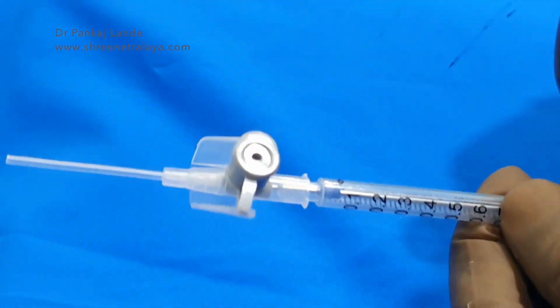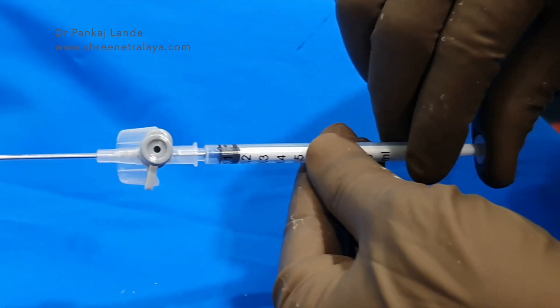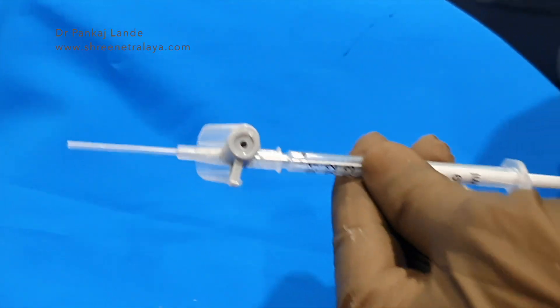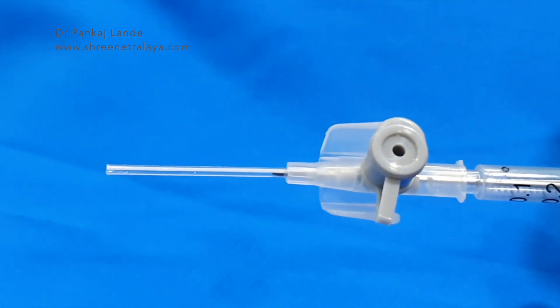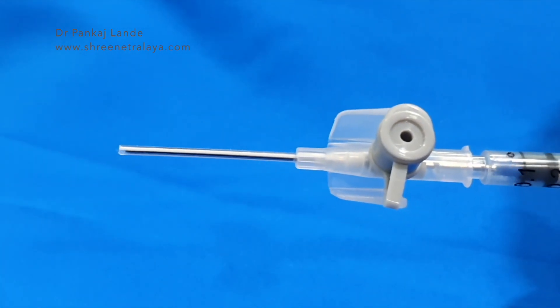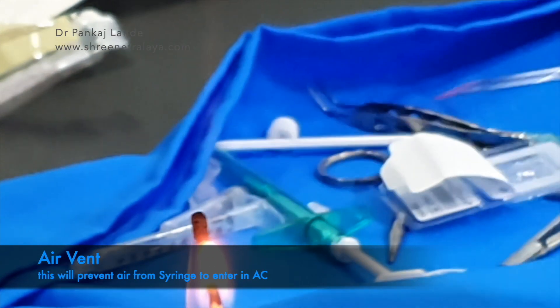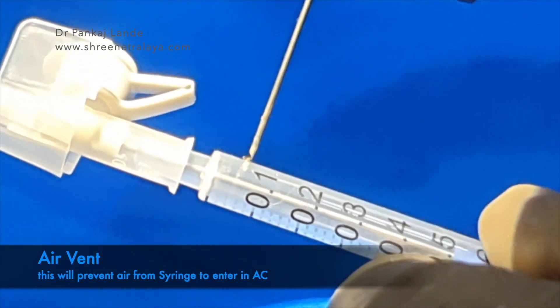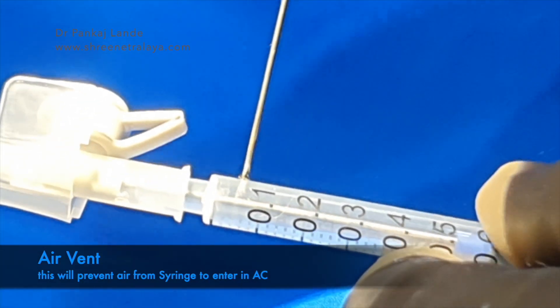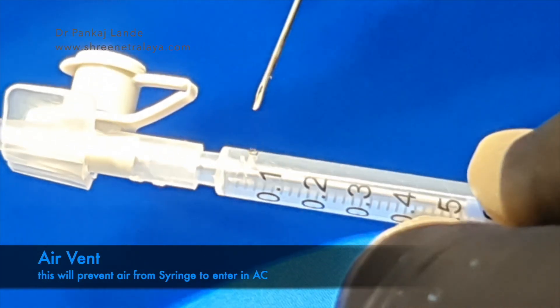Now we can attach the IV cannula to it and our inserter can go into the IV cannula very comfortably. It is very important that this metal inserter should come out of the IV cannula from the tip. If that is not happening, you can cut a small amount from the front tip. Here we are also creating an air vent, because when injecting the CTR into the anterior chamber, air may go from the 1ml syringe into the anterior chamber — we don't want that to happen.